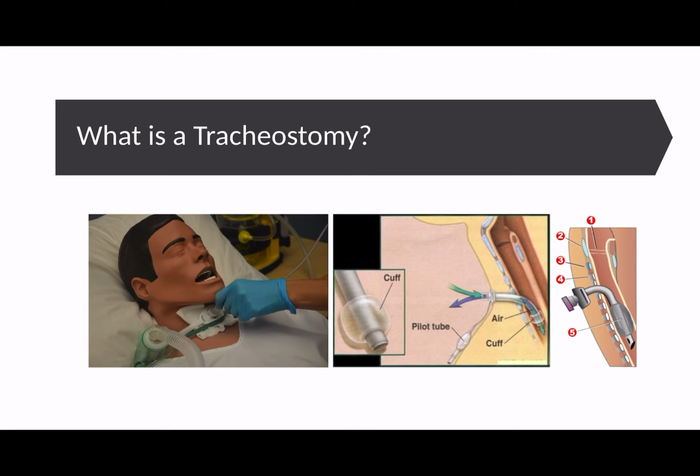So you often see tracheostomies being put in for patients who need long-term ventilation, or for those patients who have come to intensive care, spent a huge amount of time in intensive care, and there's an expectation that they're going to spend an even longer period of time needing ventilation or to protect their airway from lots of secretions or other things like persistent reflux.